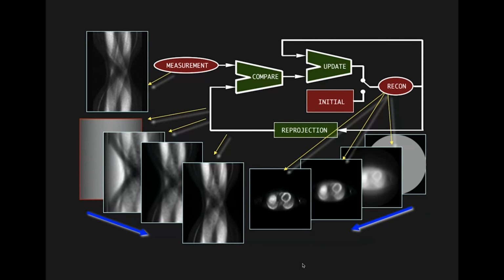What you will see is that for nuclear medicine imaging, which uses exactly the same principle, also measuring projections now of gamma rays and not of X-rays, because nuclear medicine is so noisy, they mostly use iterative reconstruction. But what you then see is that with the scanner, you put a computing cluster in order to do that. So in hospitals, next to these scanners, you can either use a local hospital scanner, or a computing cluster which is with the scanner. But it is a very computationally intensive task.